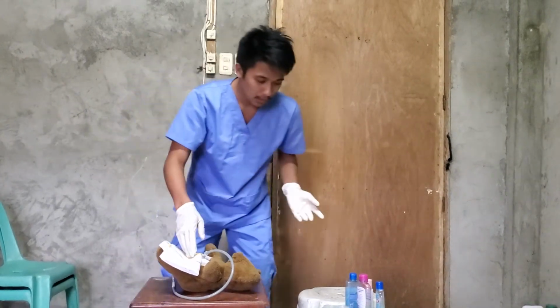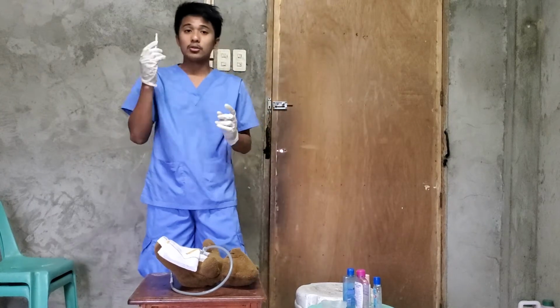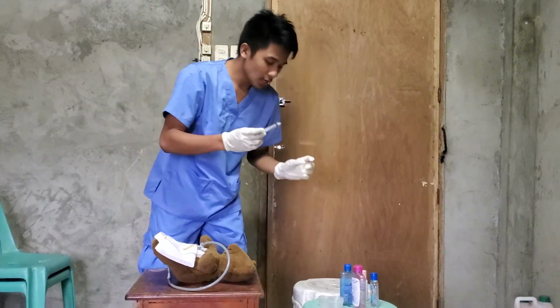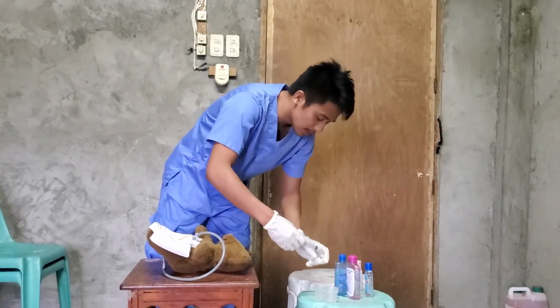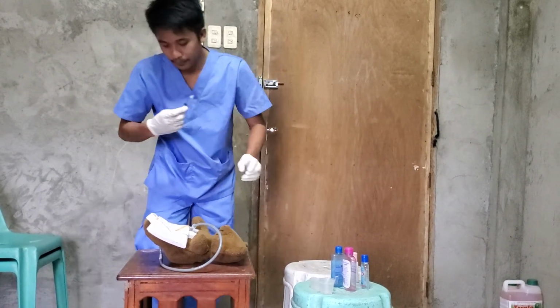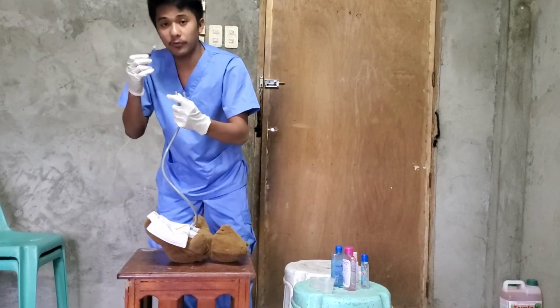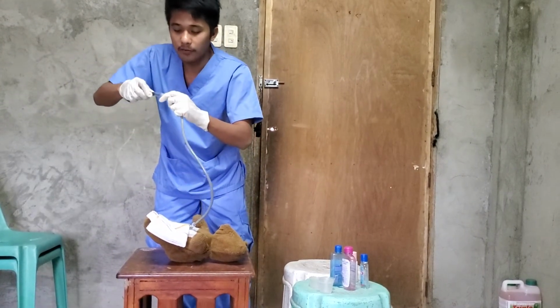Then the next step that you need to do is to irrigate the tube. So irrigate the tube by using the syringe. Using the syringe, draw water into the syringe. Then after that, insert the tip of the syringe into the feeding tube.